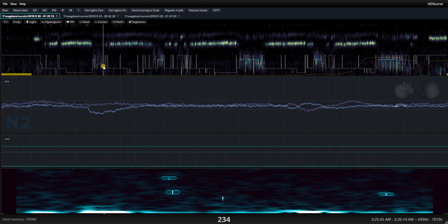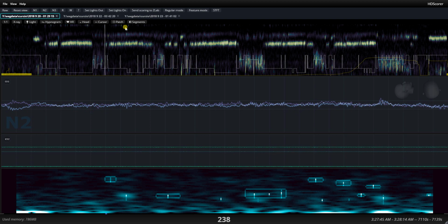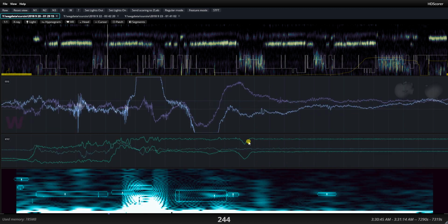So this transition that involves several types of epochs, where sleep is not even stable, looks to me to be entirely plausible based on what I see. And that's a reassuring factor in my opinion. This is a major body movement. It's scored as wake, and you go back to N2.